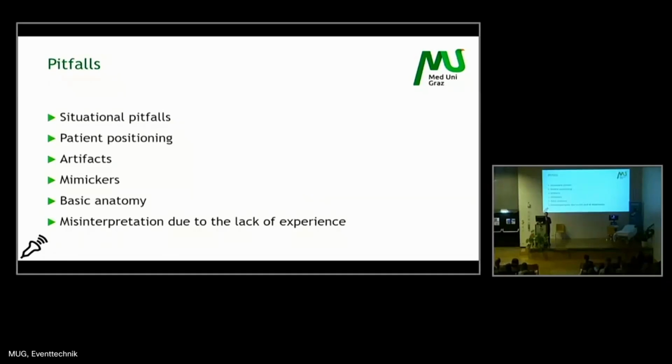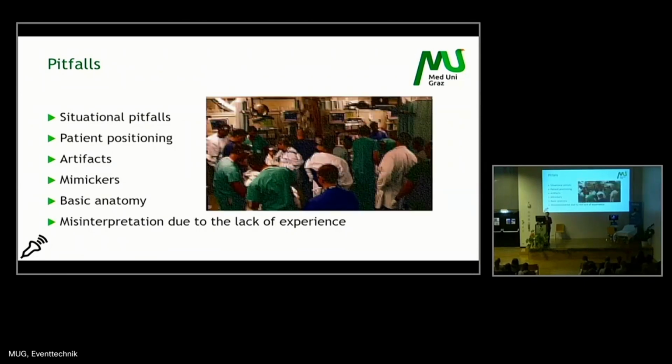What I'd like to point out, there are some pitfalls for eFAST, especially situational pitfalls. As you can imagine, an emergency room is always very crowded, and at some point you will do eFAST for the first time. So don't let the situation get ahead of you. Be confident, take your time, you know how to do the eFAST. Just do it step by step.